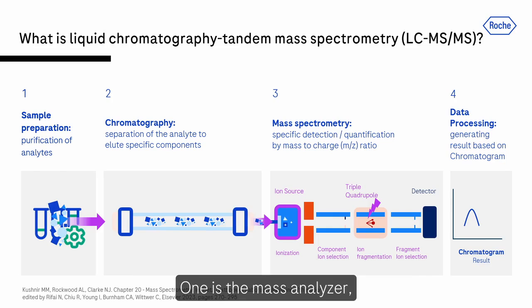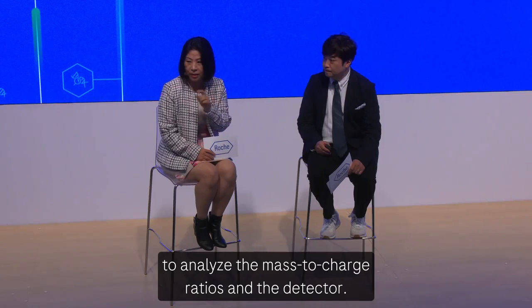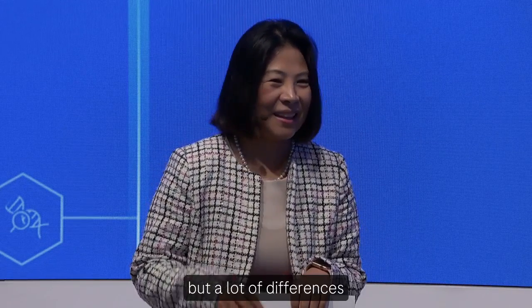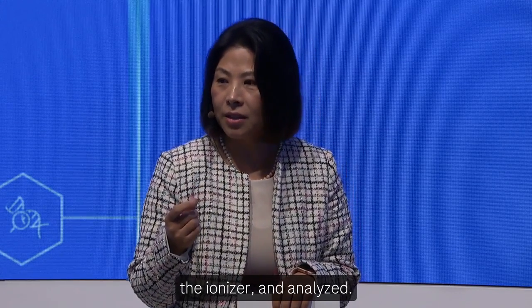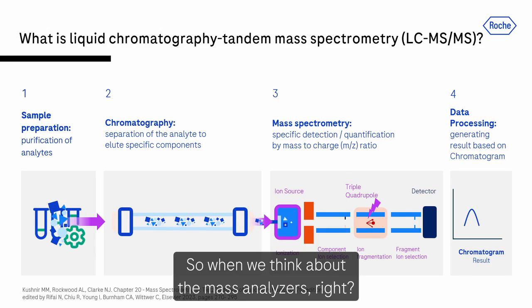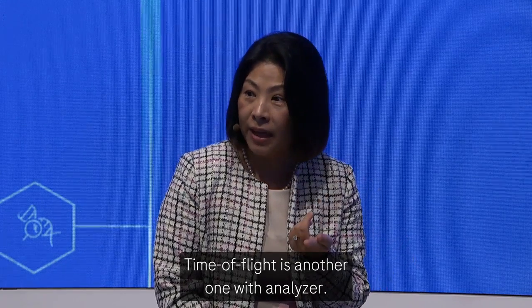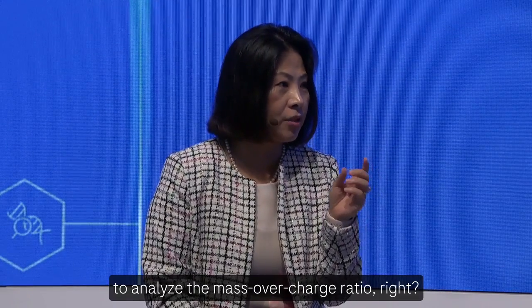We have the ionizer, which gets the compound ionized, then the mass analyzer, which analyzes the mass to charge ratios, and the detector. Detectors typically aren't much to talk about, but there are a lot of differences in how we ionize and analyze the compound. Here we're showing a triple quad, as most people see. Time of flight is another type of analyzer. The goal is the same: to analyze the mass over charge ratio.